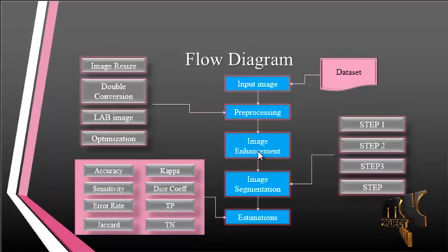After the enhancement, the image segmentation will be carried out. In the image segmentation, we have 4 steps: step 1, step 2, step 3 and step 4. In these 4 stages, we apply the morphological image segmentation method to segment the retinal region from the other background region. Only the vessel region is extracted by these 4 steps and the other remaining regions are eliminated.